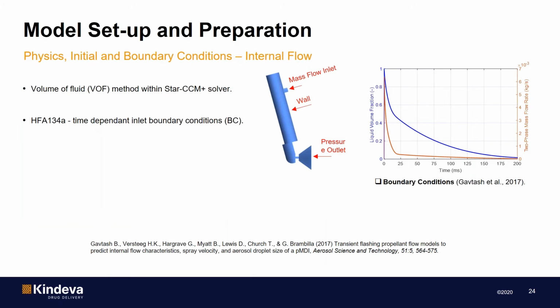Now, moving on to the physics and boundary condition. In the internal flow model, the expansion chamber is assumed to be filled with air at atmospheric condition at first. HFA 134A propellant enters this space through the valve orifice at a mass flow rate with an instantaneously varying vapor content that we calculated by a separate model, and we have been using this extensively before.